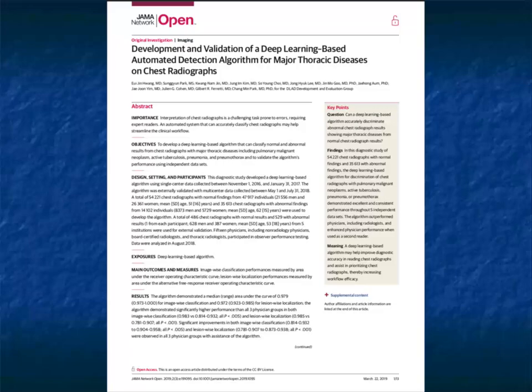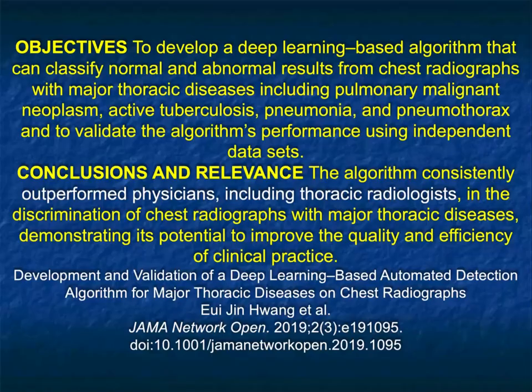We left off last time mentioning a little bit about the chest and AI. One of the areas you're seeing tremendous growth in AI is in chest imaging. I mentioned some of the FDA approvals for being able to pick up pneumothorax or pulmonary embolism. But here was an article talking about the development of deep learning algorithms for detection of major thoracic diseases on chest x-rays. And in fact, that was their goal.